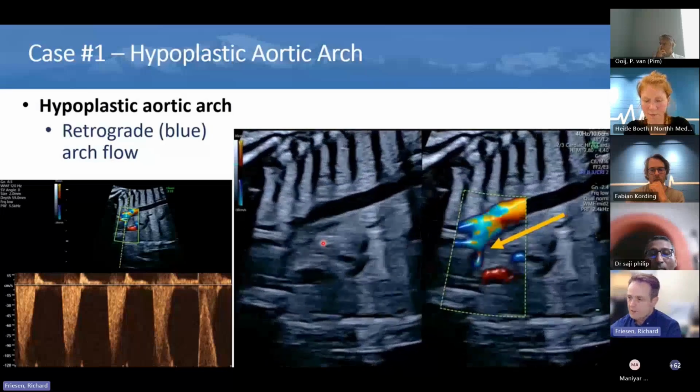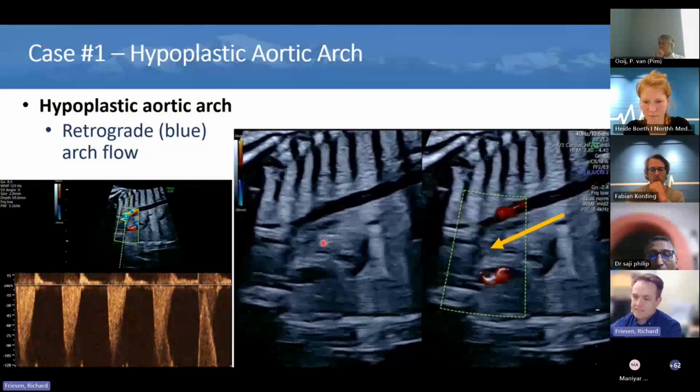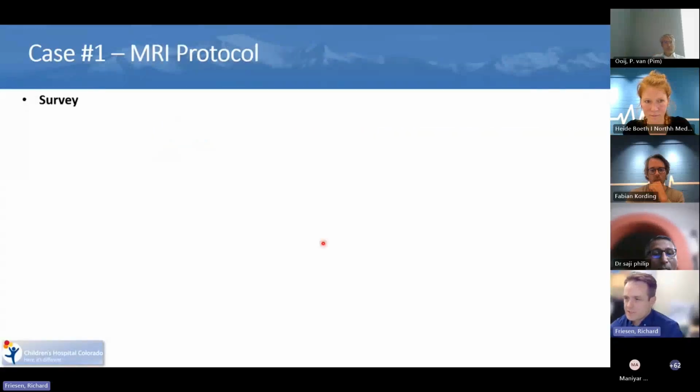Neither one can be, in certain complex cases, neither one is standalone, but very complementary to each other. So this gives us a little bit of idea of what we're looking at. So quickly, I'll go through our MRI protocol, and then we'll get to some more images.